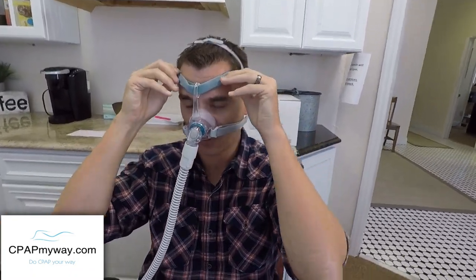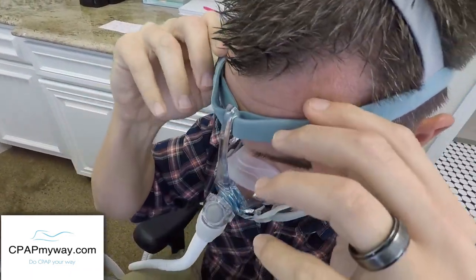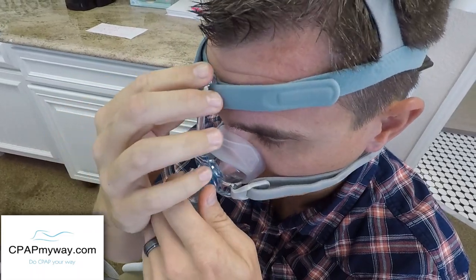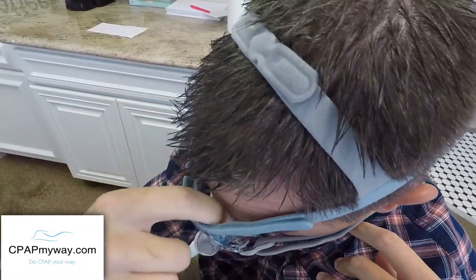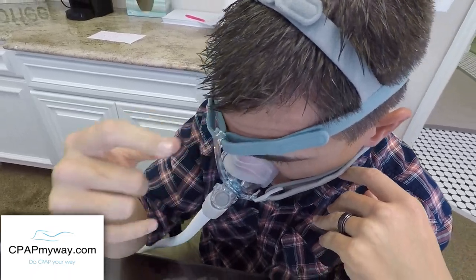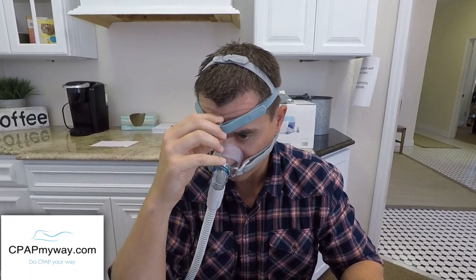And then the forehead piece here, I talked about a little bit. See, it's not touching my forehead. A lot of people want to crank it down and tighten it up to the point where it's wedged up against their forehead, but you can have a gap there, which is nice. So it's not really a downside, but it is kind of a funky thing about this particular mask that it's a little bit different.